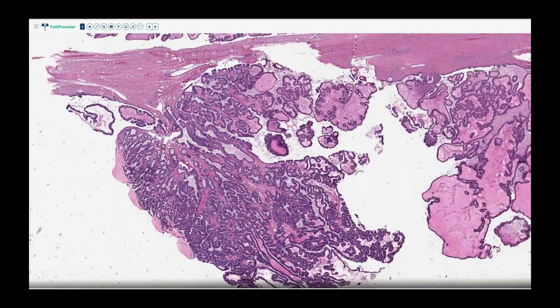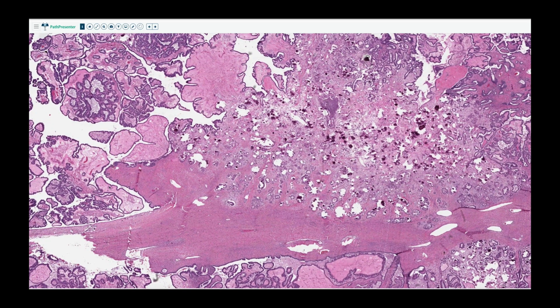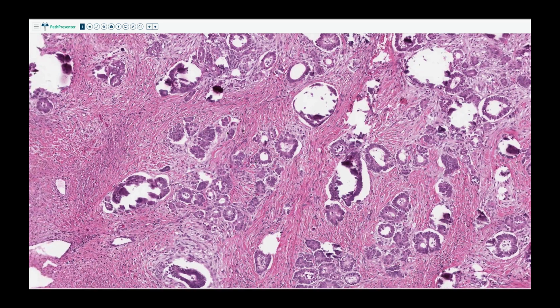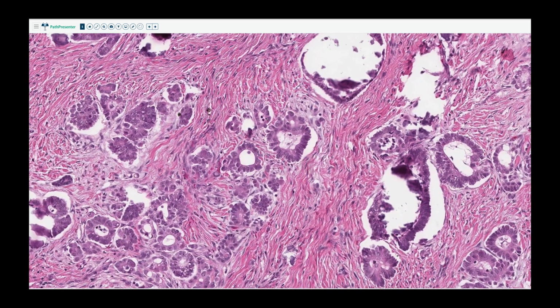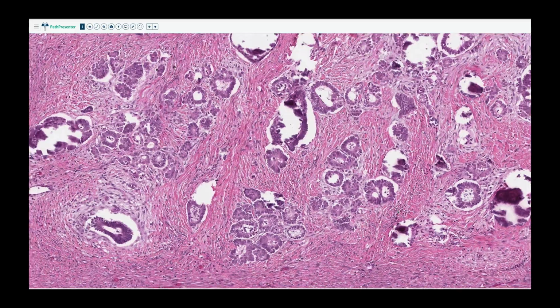So that's there. And then the other interesting thing about this slide, and this patient ended up having a more interesting diagnosis elsewhere in her ovary, I imagine that she had some micropapillary architecture because she does have invasive disease here. So she has these papillary projections diving down into her stroma, which are lined by cells that are morphologically a little bit different. They resemble sort of a low-grade serous proliferation. So these are invasive implants arising within a borderline tumor.